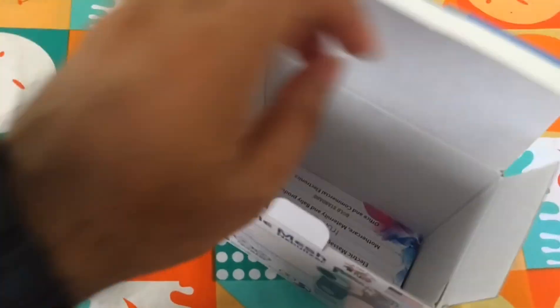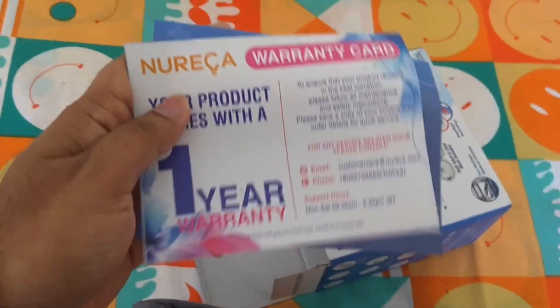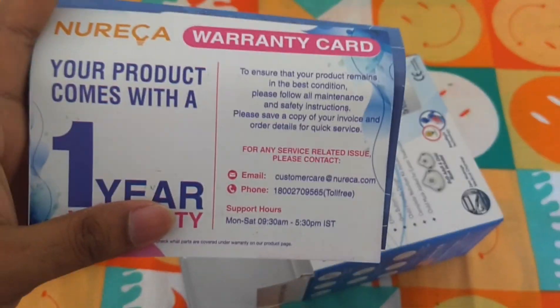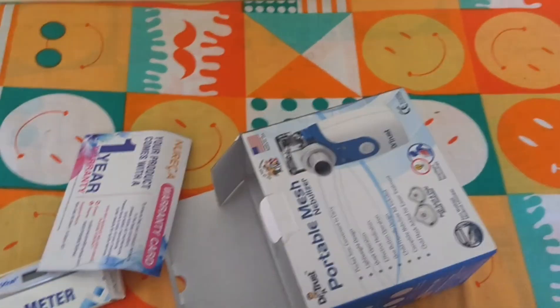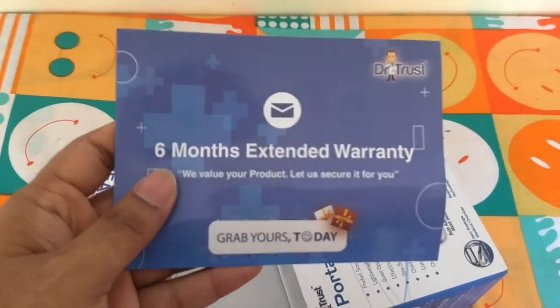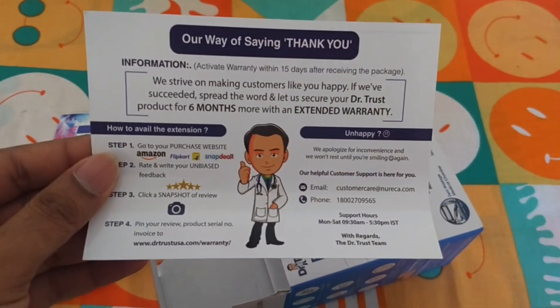The entire unit is kept in a bag. The box also contains some warranty cards. This is a one-year warranty card. This is a six-month extended warranty that we need to apply by posting some comments or a review on Amazon.